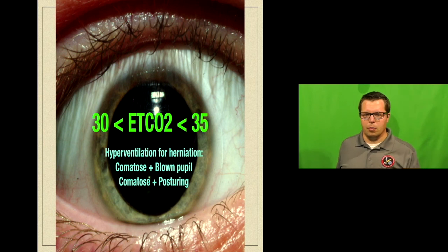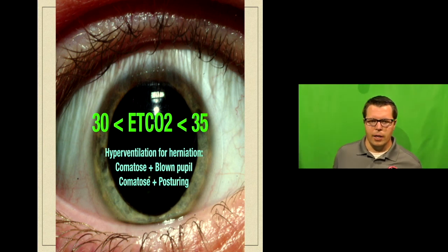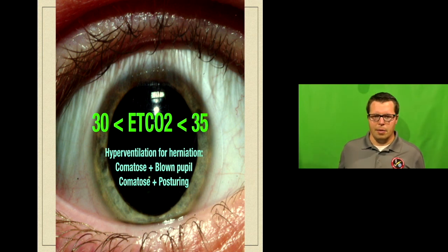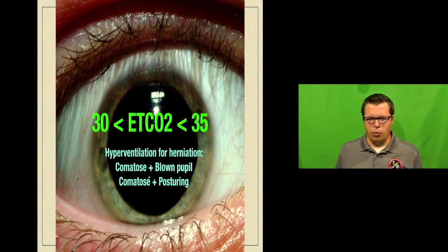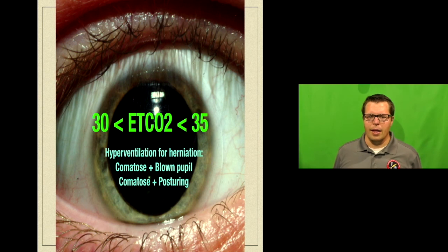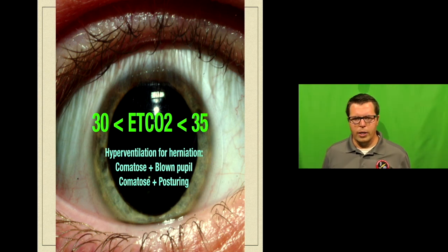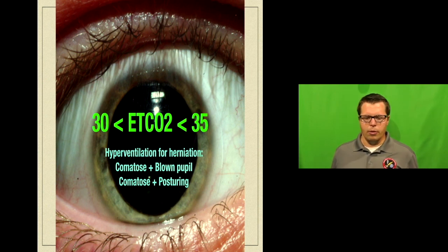So if they're comatose and they have a blown pupil, and they're posturing, then you may choose to mildly hyperventilate them in order to cause some vasoconstriction in the brain and give you a little bit more space and stave off herniation for a little bit of time, assuming you're being treated appropriately otherwise. And the goal on that one is probably going to be to bump their respiratory rate to about 20, and their end-tidal CO2, in that case, you'll target between 30 and 35.